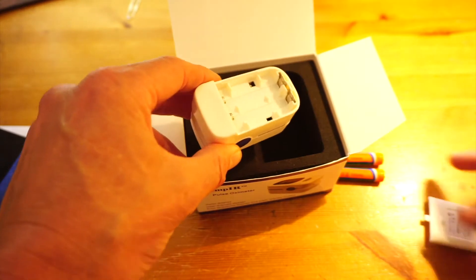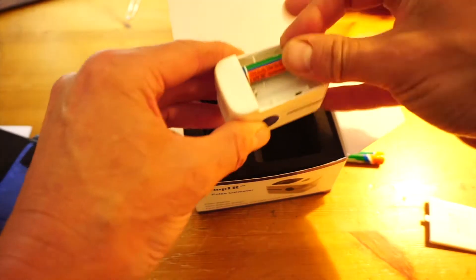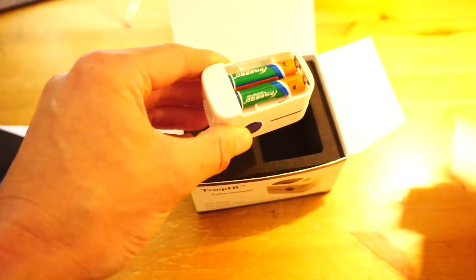Just pop the back off by sliding it in the direction shown by the arrow. Insert the two AAA batteries and you're ready to go.